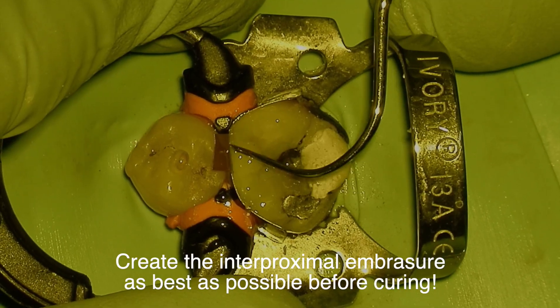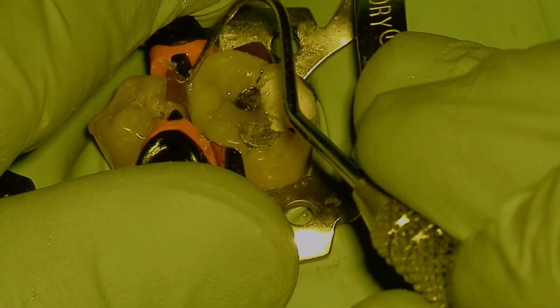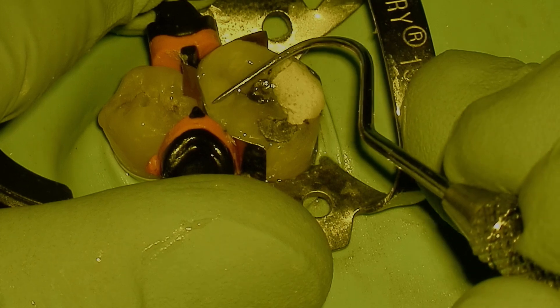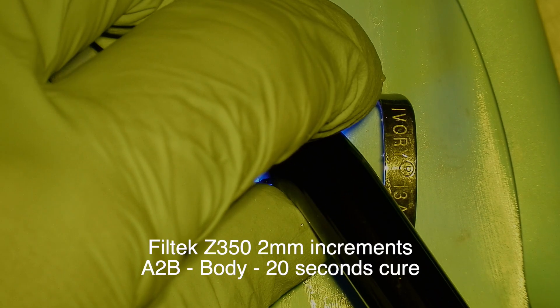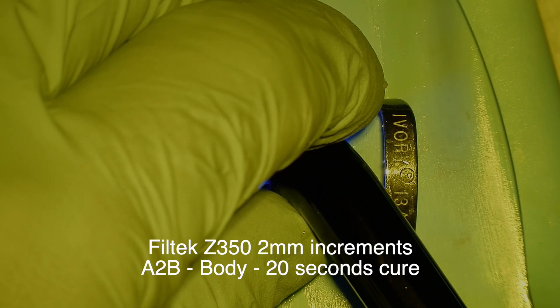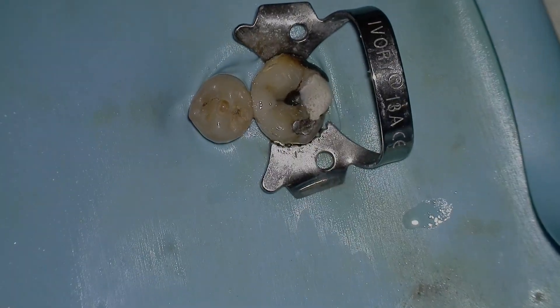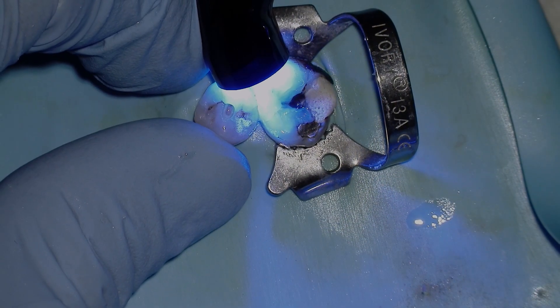Consulting experienced providers, we all agree the most important thing at this stage is creating the interproximal embrasure — take the time with an explorer before you cure, because creating it with mechanical instruments afterward is very difficult. The composite is cured in 2mm increments in a body shade at 20 seconds per cure. Then disassemble everything and finish light-curing on the proximal side — buccal and lingual.